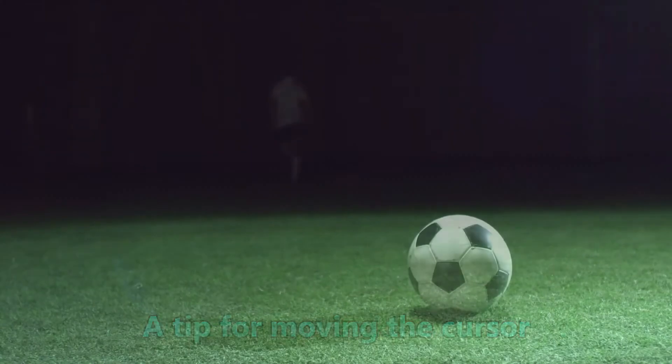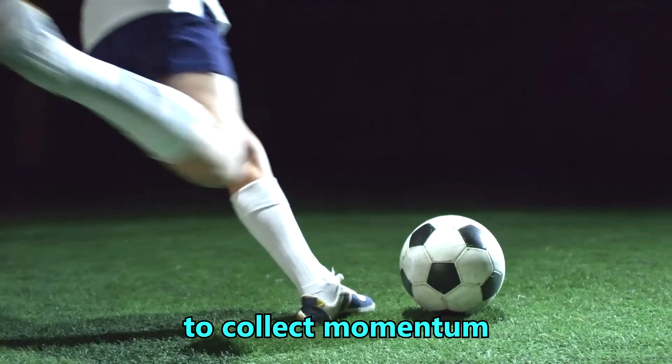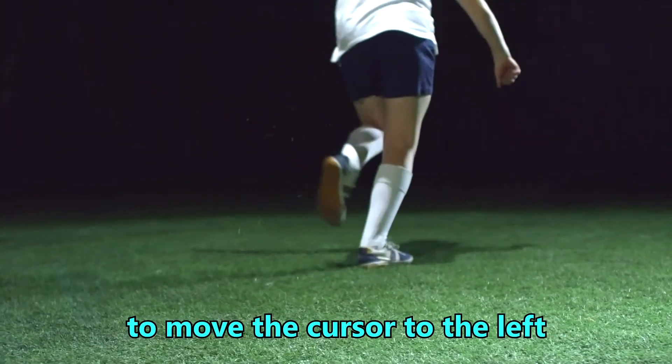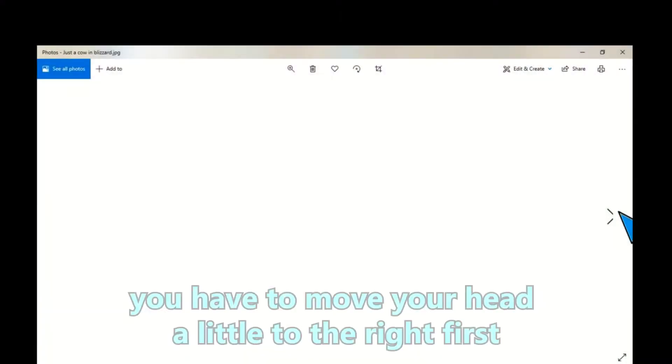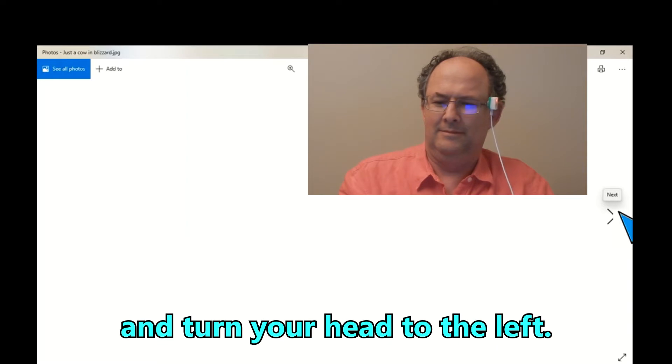A tip for moving the cursor is to compare it to kicking a ball. You have to swing your leg back to collect momentum before kicking the ball forward. Just like that, to move the cursor to the left, you have to move your head a little to the right first and then turn your head to the left.